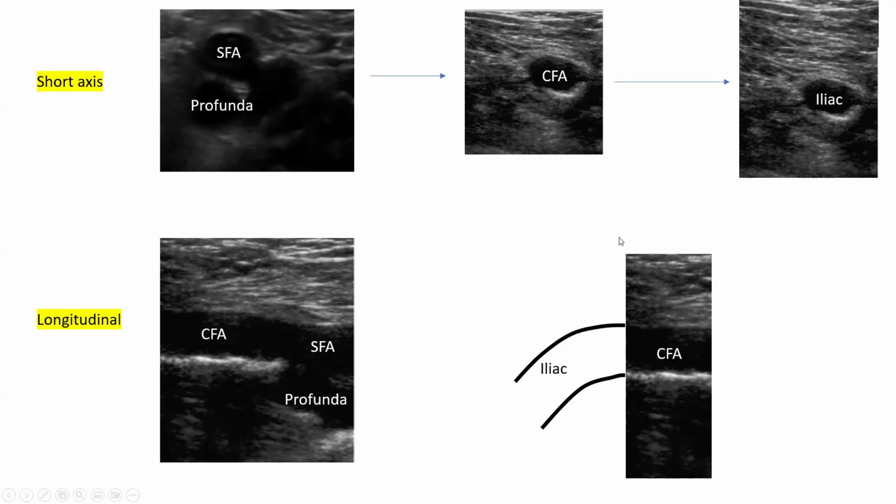And in difficult cases, especially there are some patients who have a very small common femoral or a very short common femoral artery where you see the bifurcation, then you see quickly it bends down. So in those cases, it's hard to nail the actual common femoral. And I encourage you in those cases to maybe sometimes stick under longitudinal ultrasound. And keep in mind in those cases, sometimes I worry, you see this on the ultrasound, and you aim to stick that, not that.